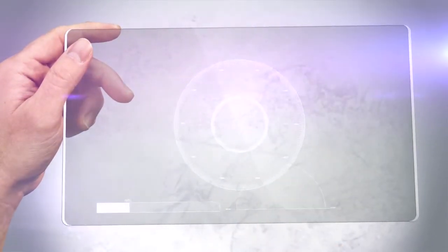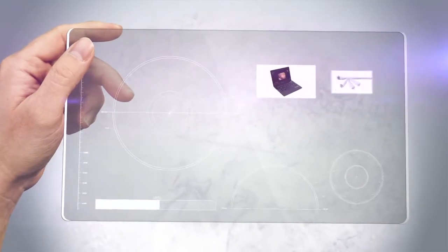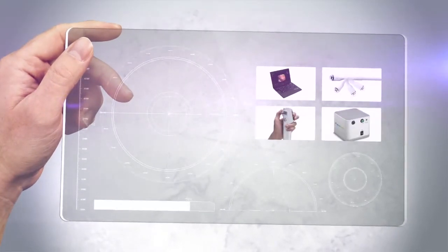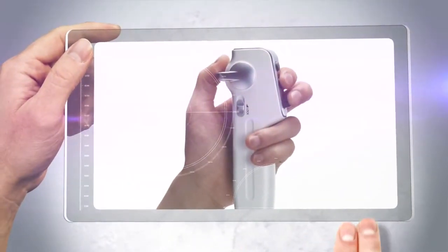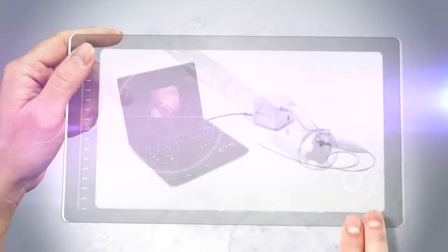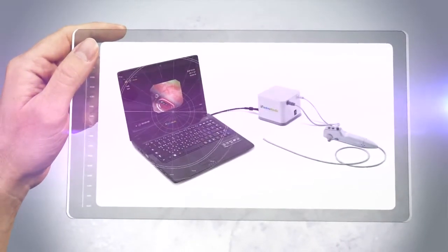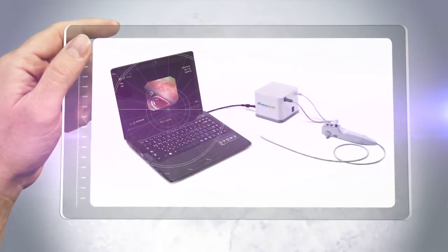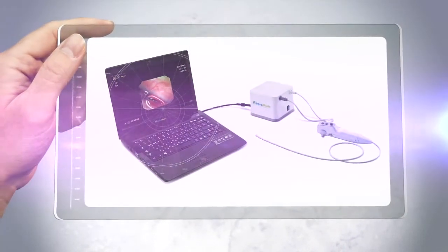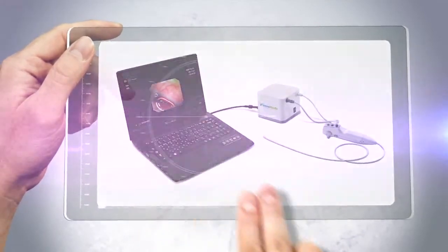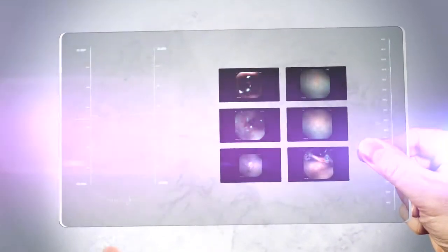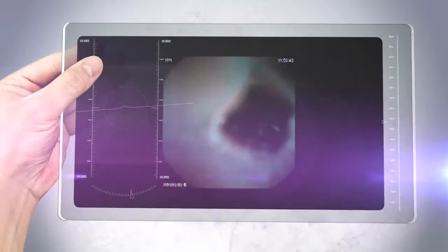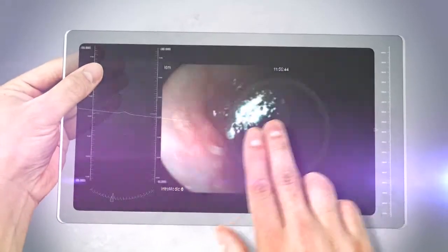EG Scan is an esophagoscope designed to visualize the lining of the esophagus as an adjunctive tool in the detection of abnormalities of the esophagus. Visualized images are viewed via EG View software, installed on the display system for diagnosis of disease related to the esophagus.